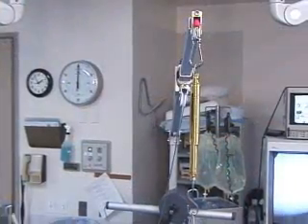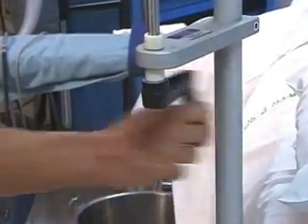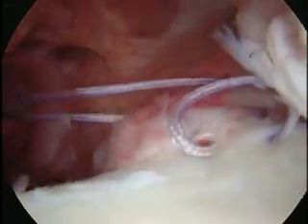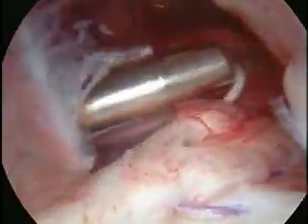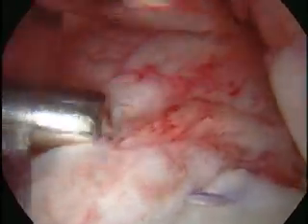The lateral control strap is given 12 to 15 pounds of traction, which can be verified by the traction scale. Adjustments for raising and lowering the boom are made by cranking the black handle at the back of the three-point traction system. For posterior capsular stitching and inferior capsular plication, I always like to do those stitches with the arm in 70 degrees of abduction. I don't want the arm adducted or close to the body because that allows the capsule to be very loose, giving a tendency to take too much tissue when doing stitches. With the arm already in 70 degrees of abduction and the scapula rotated slightly, you can take up just the redundant capsule when doing your stitching.